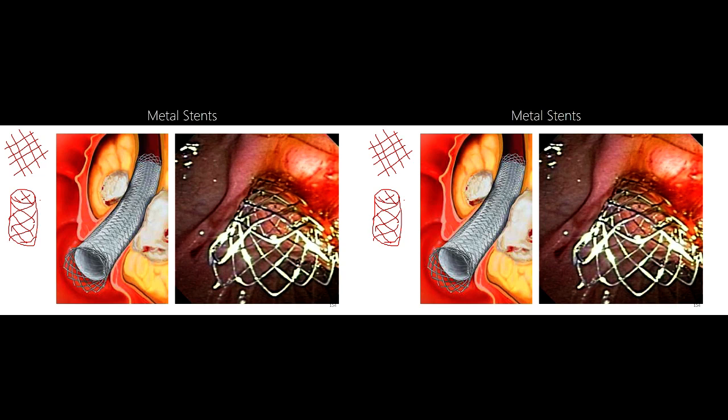We could construct that tube to have whatever length and whatever diameter we want. Great, so we do that. Then what we do, get your catheter once again, then get that stent super duper tightly over the top of the catheter with a little plastic cover on it.